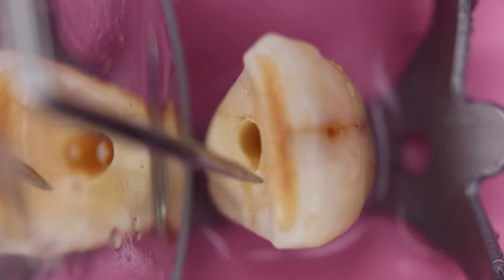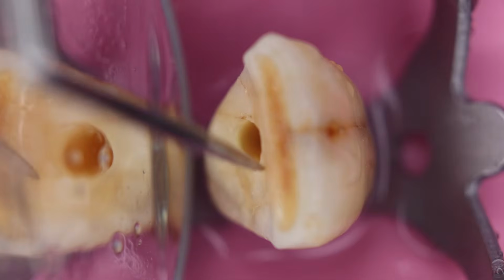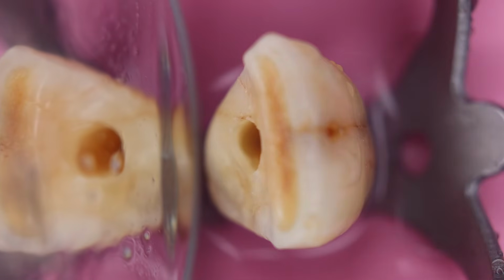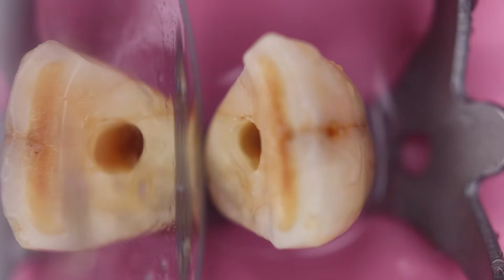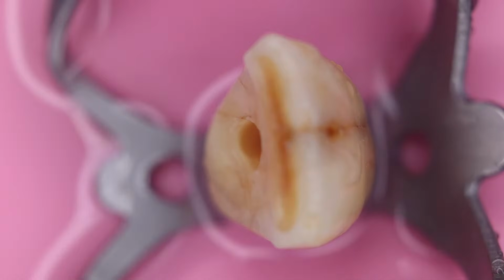So this shape would be roughly triangular with the broader base at the incisal and tapering towards the root. So for that you can use the endo access bur initially, and then we can use the tapered fissure bur. So we will start with the AtoZ bur. This is the 7th point that you need to remember.